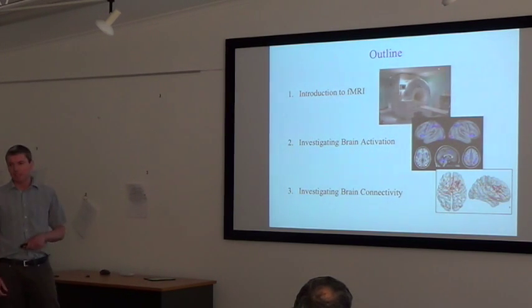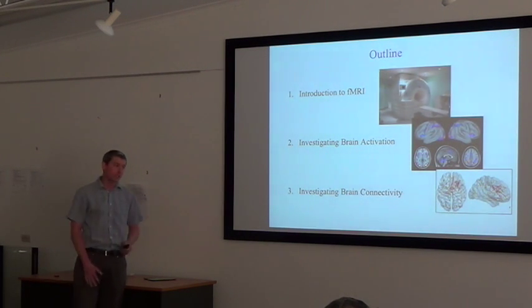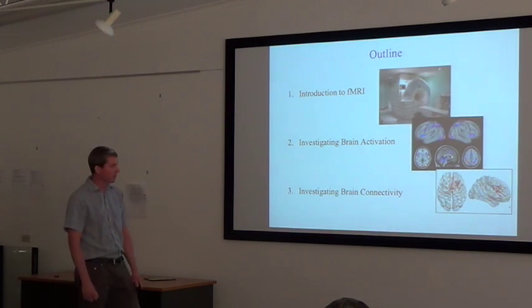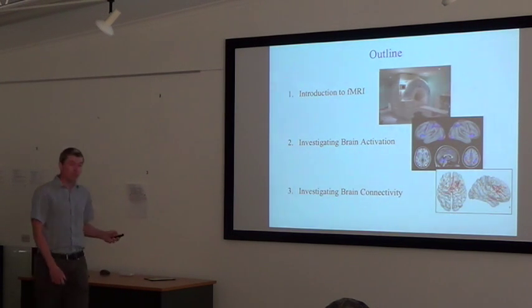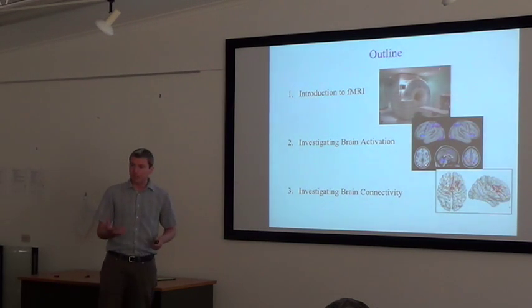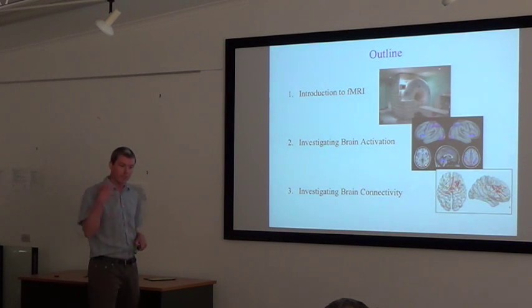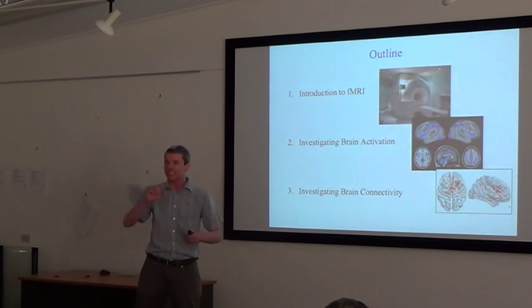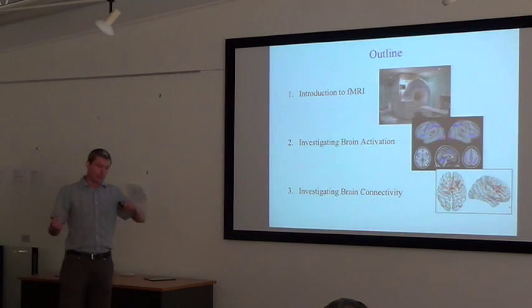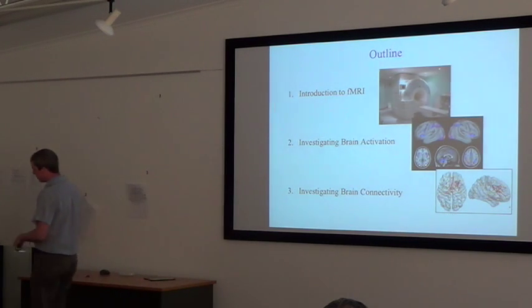And in terms of pathology, I've got some examples of blob maps that show pathology in various psychiatric illnesses and what that might mean for our interpretation. Then we're going to touch on brain connectivity, which is all the rage at the moment. This is functional connectivity, as opposed to what Pranesh was talking about in terms of anatomical connectivity, being the white matter connections, the actual axons in the brain. Functional connectivity is more about how brain regions interact in a functional sense.